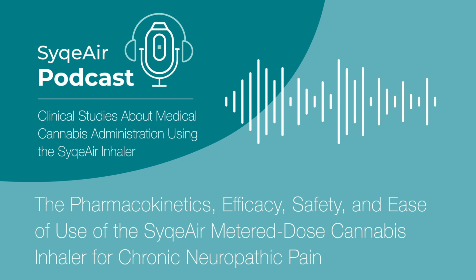All right, let's recap what we learned today. We looked at a study on the SyqeAir Inhaler. Right. This device could be a game changer for treating chronic neuropathic pain because it delivers precise doses of cannabis. And the results are impressive. The inhaler delivered THC really quickly and efficiently. Yep, peak blood levels in just 3 minutes. That's right. And it's as fast as smoking, but without the smoke and all the harmful stuff.